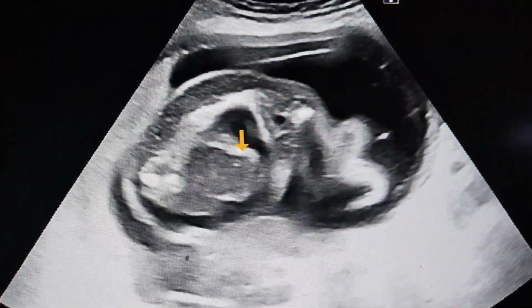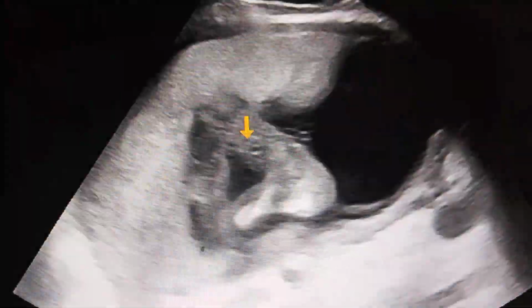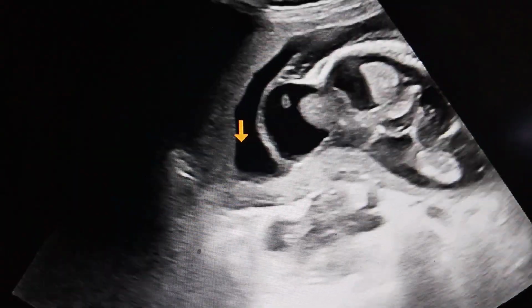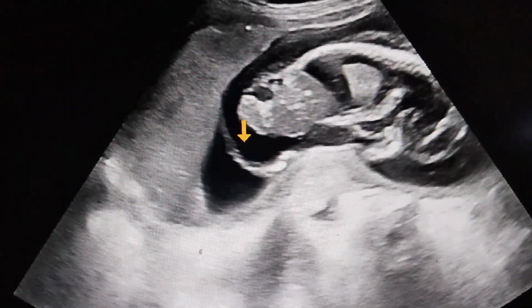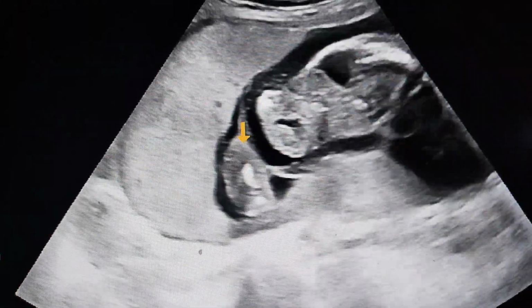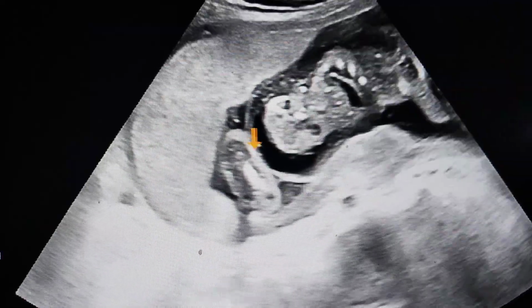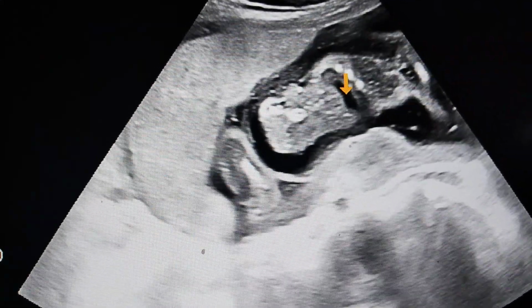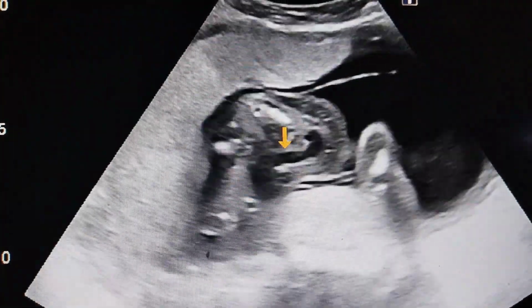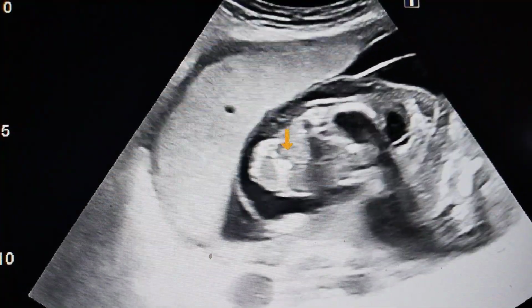And now we are going downward to see the abdomen of the fetus. So this is the abdomen, and this is the ascites. So we can say that this is a case of Hydrops fetalis.